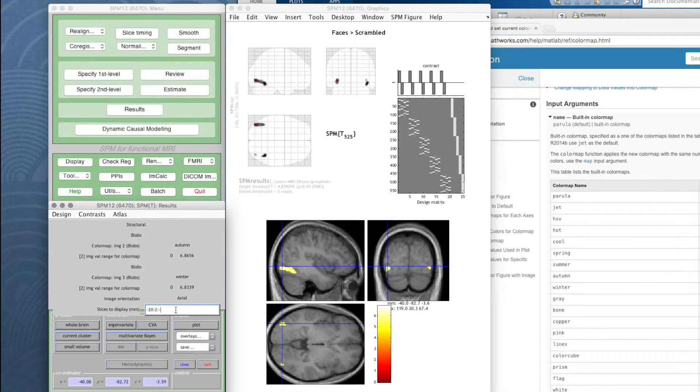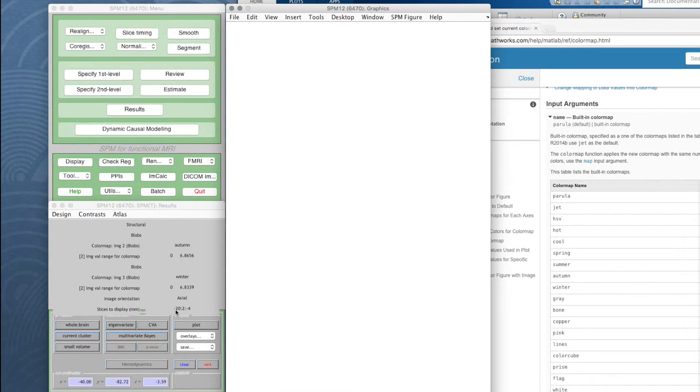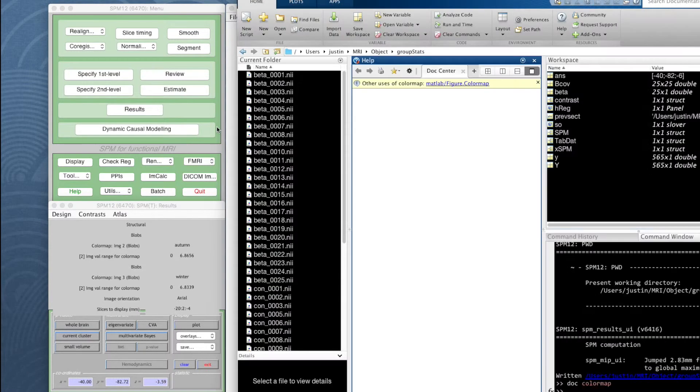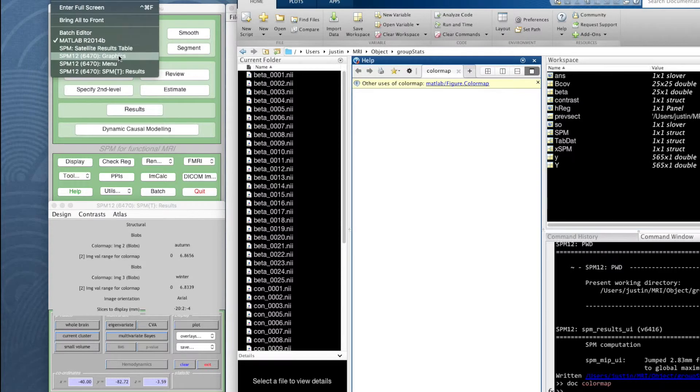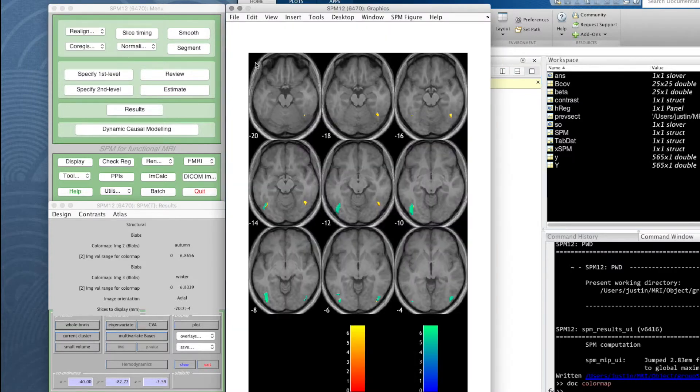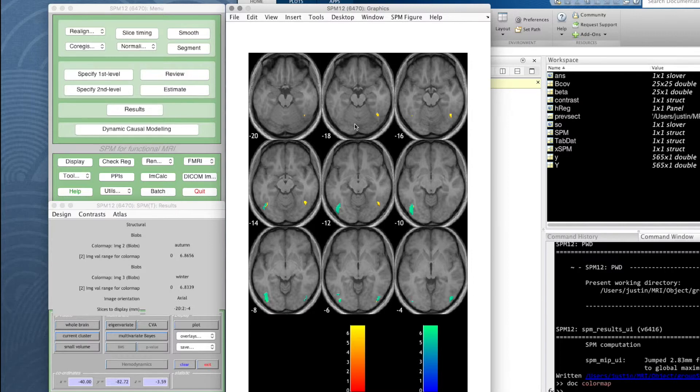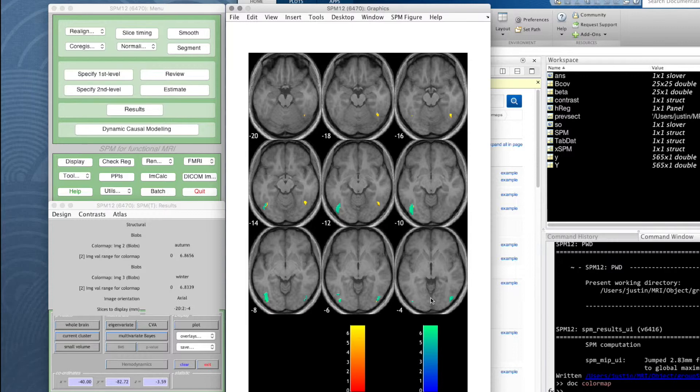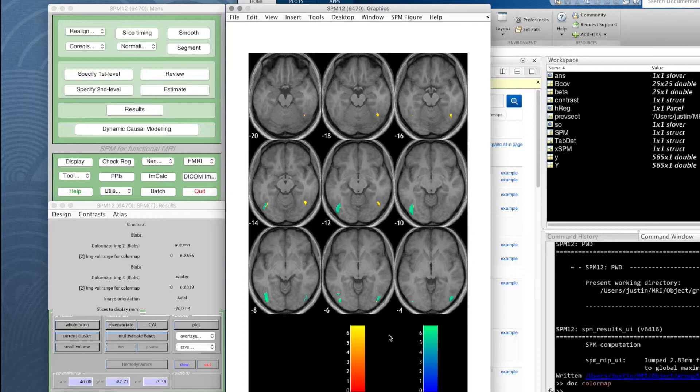I think we went up to about minus four. So if we do that, the graphics window then displays the slices from minus 20 in steps of two up to minus four with the autumn color map and the winter color map. Autumn color map for the face data and the faces minus scramble contrast, and the winter color map for the object data.